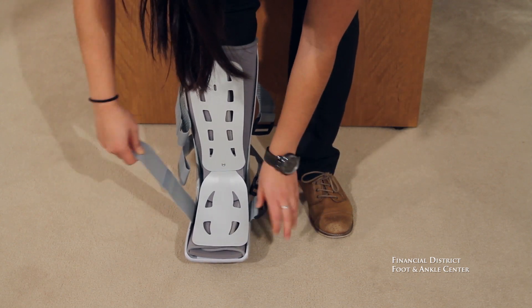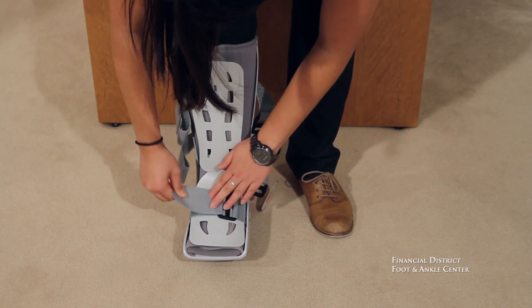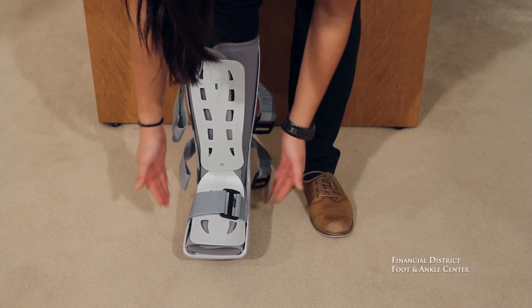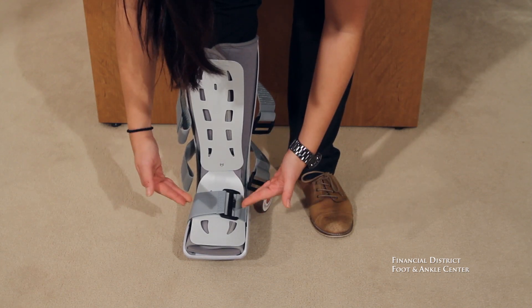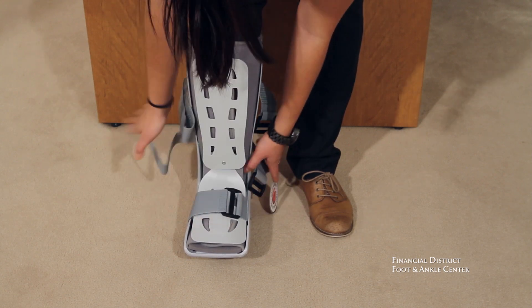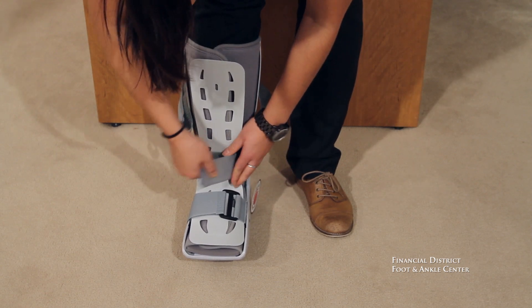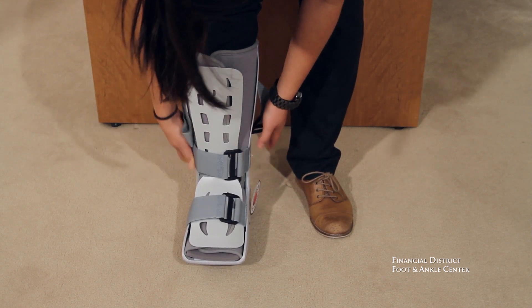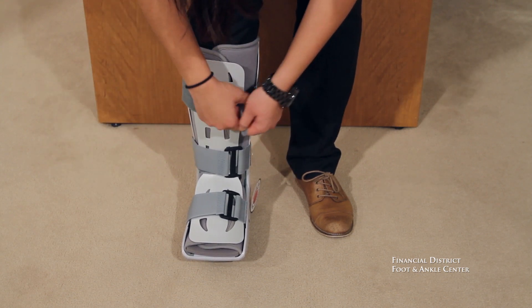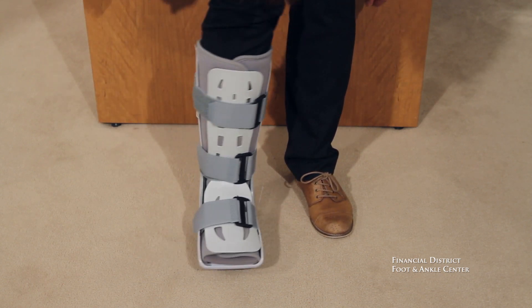Then we're going to start at the toes and strap it in. Now when you're velcroing, you want to make sure that it's snug but it's not strangling your foot — you should feel nice and secure with just the straps. And the last one. Great, and then it's fit.